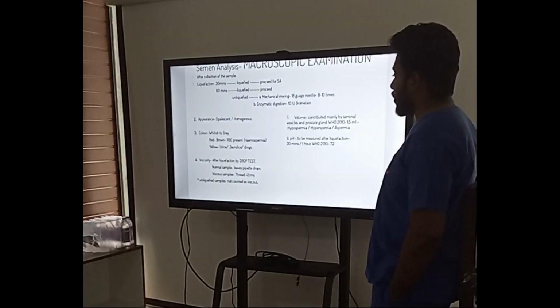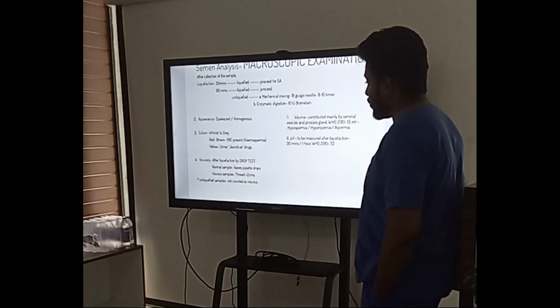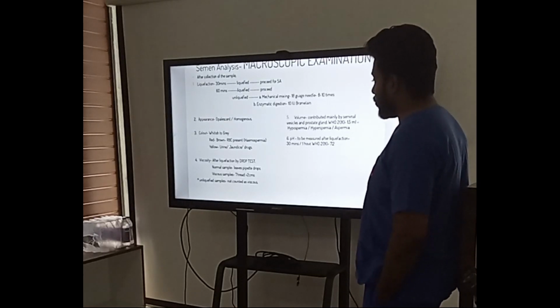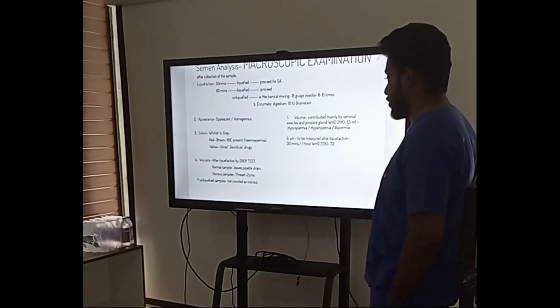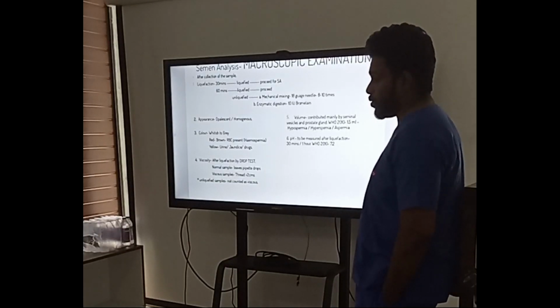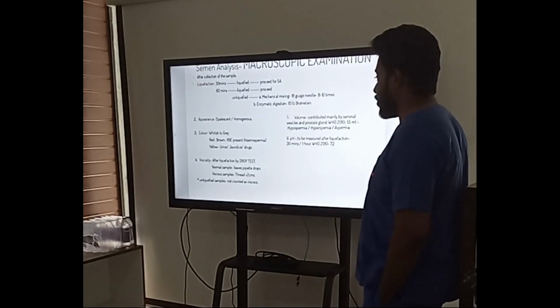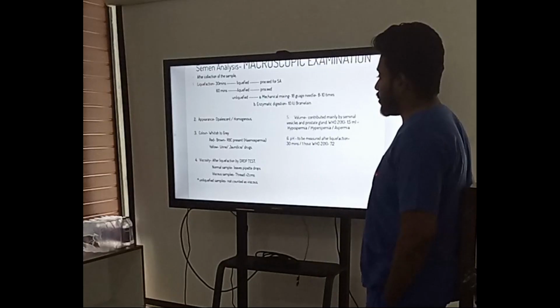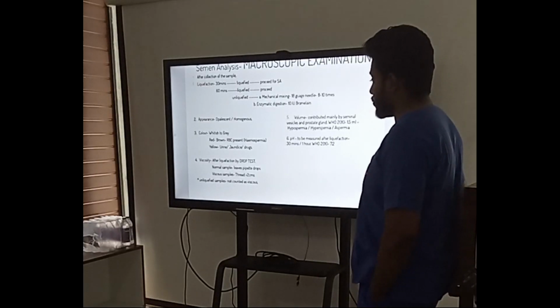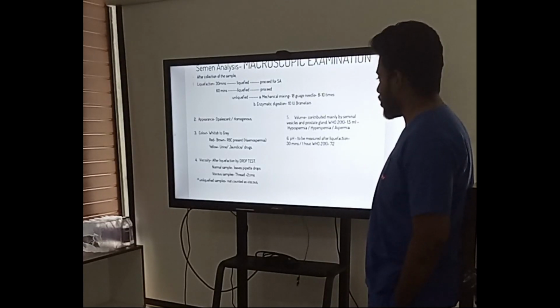And the appearance, we have to note it down, because that also denotes what the patient is going through. It should be opalescent and homogeneous. Sometimes the color we also have to note: whitish to grey, red to brown, or yellow. Yellow denotes that after ejaculation they must have collected urine as well, or retrograde ejaculation could be an issue. If the patient has brown semen, then the patient has some infection or hemospermia, which leads to the presence of RBC. The whitish to grey is what we require for a normal semen analysis.